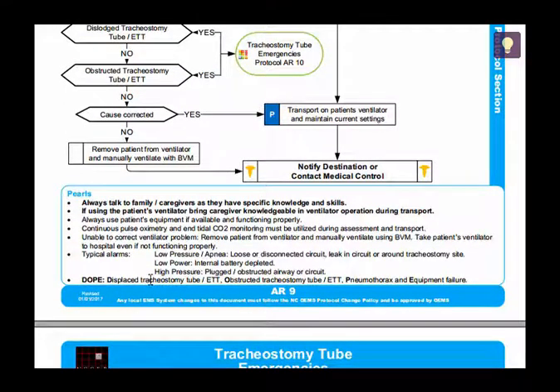But one thing to keep in mind with ventilator emergencies is the DOPE algorithm, which is if there's a displaced endotracheal tube or tracheostomy tube, or if it's obstructed, which could be from a mucus plug or food particles or something else. The other one is pneumothorax, which is something that all of us can assess for, which can happen when somebody's under positive pressure or after any trauma. And then the other one is equipment failure, which is troubleshooting sometimes the plumbing, sometimes the electrical aspect of it. So just want to bring that up.